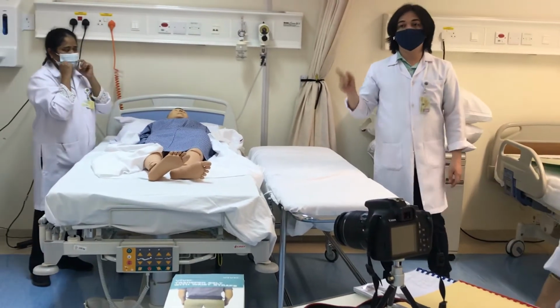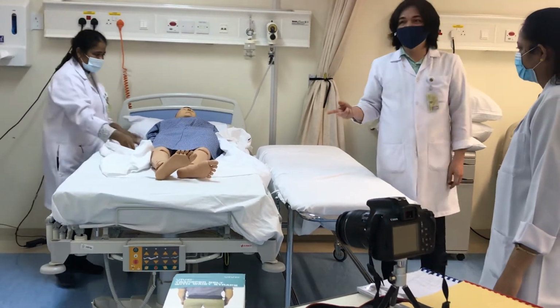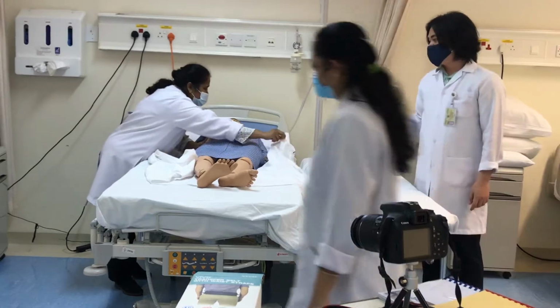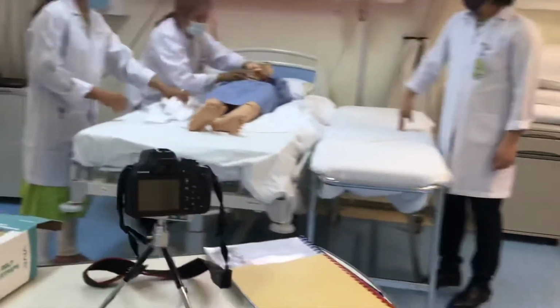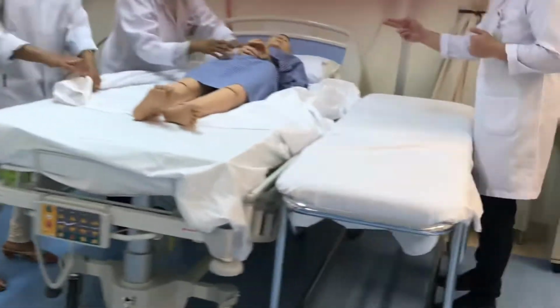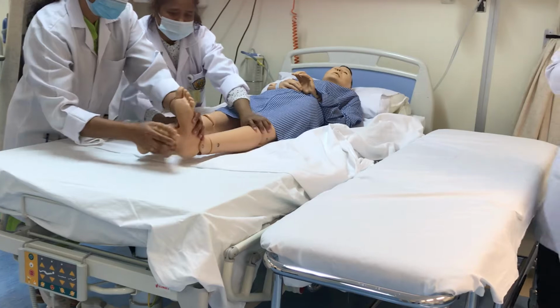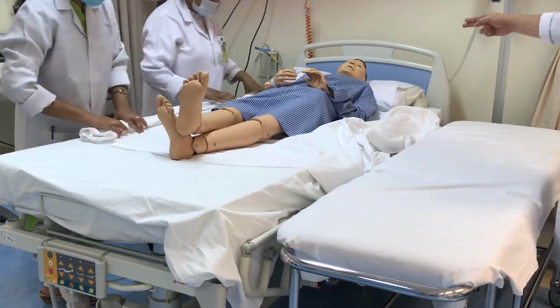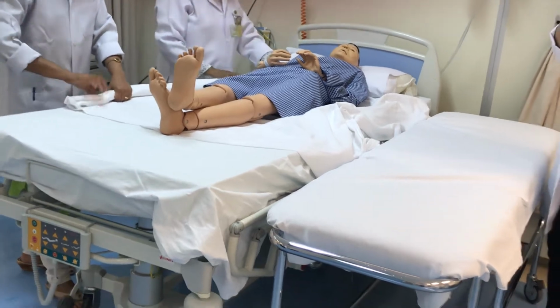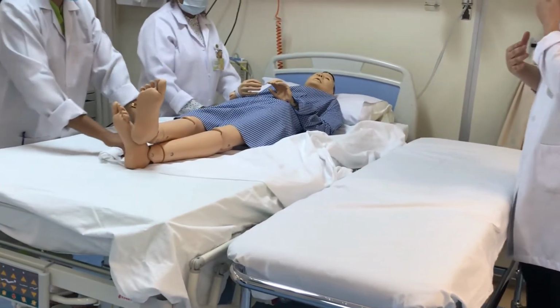This procedure requires more than one nurse. You cannot do it by yourself. At least 3 nurses should be there. You can have 2 nurses on the other side and 1 nurse here if it is possible. Now, the preparation of your patient is the same with what we've done earlier. Hand over the chest, one foot over the other, and we can ask our patient to flex the knee, the neck, if we want to transfer the patient.